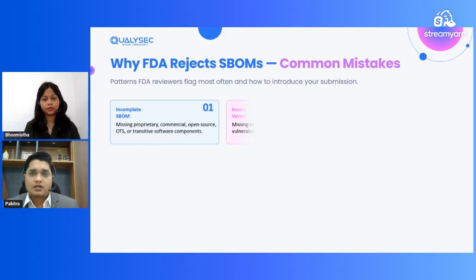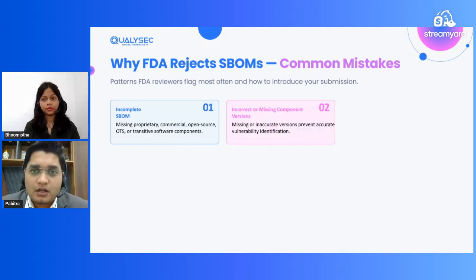Move ahead. Incorrect and missing component versions. I saw many companies and compliance auditors write down the component name but miss the version. For example, OpenSSL. For example, we are using OpenSSL for encryption. So what is the exact version of it? Is it 1.1, 1.0, or 3.0? You have to clearly mention it, because the version actually affects some CVEs.